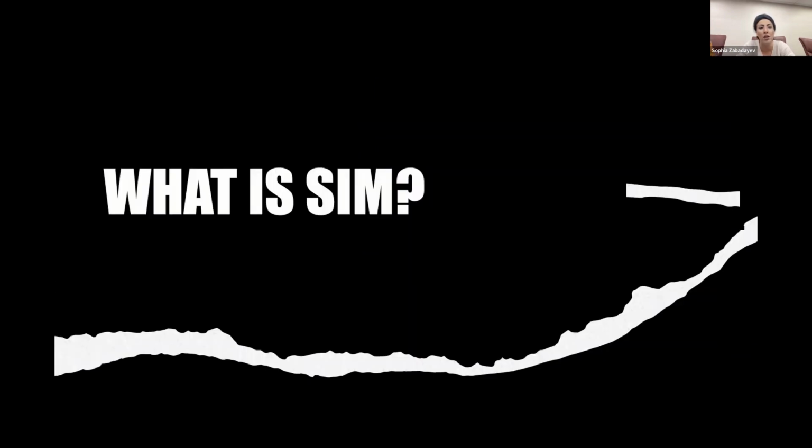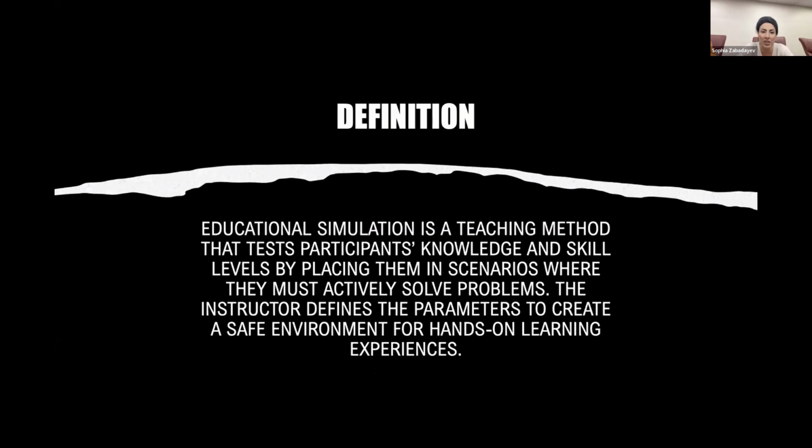So what's SIM? Technically the definition is that educational simulation is a teaching method that tests participants' knowledge and skill level by placing them in scenarios where they must actively solve problems. The instructor will define the parameters to create a safe environment for hands-on learning experiences.